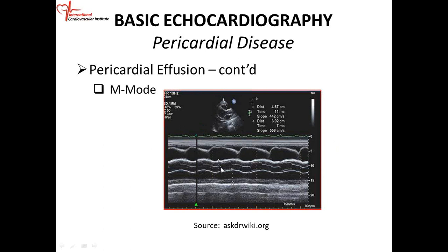But you can do that because below here, you have the aorta with the aortic valve inside. And the aortic valve only opens in systole. There's no other way. The aortic valve opens in systole, closing diastole, opens in systole, closing diastole. So if you follow, the collapse is only when the aortic valve is closed.